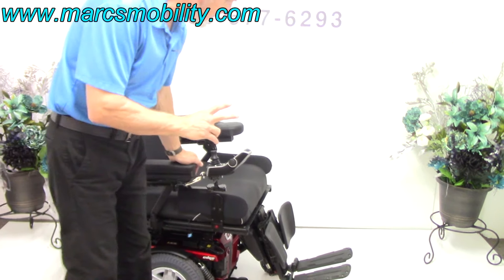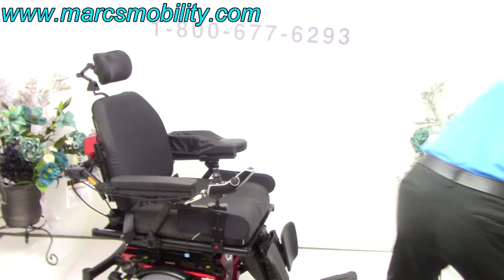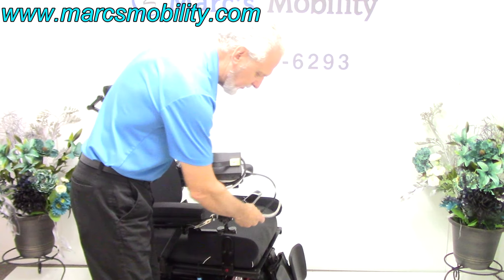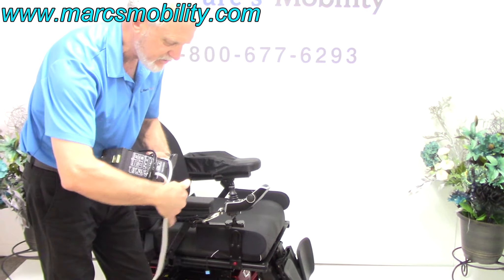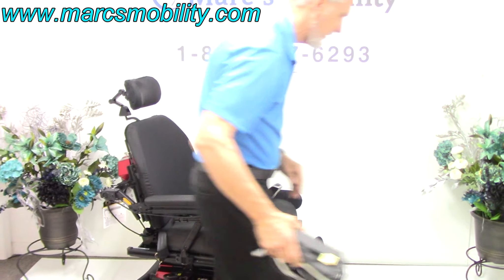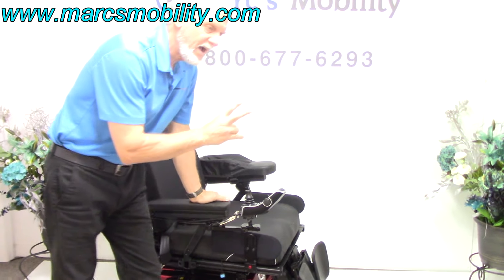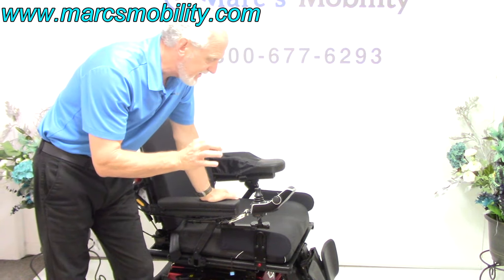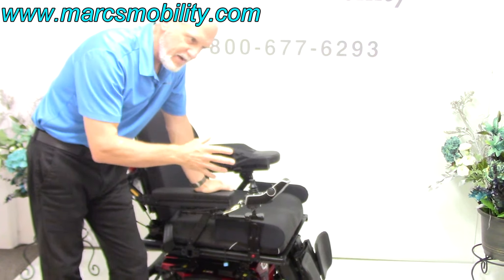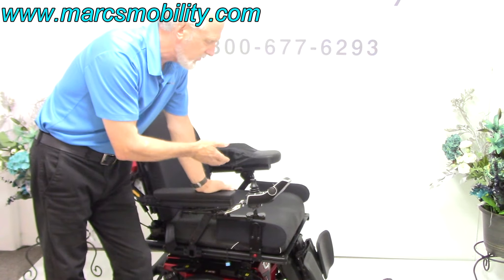There are two batteries in this chair. To charge it, plug the charger in below the joystick. When the light turns green, it's fully charged — you don't need to worry about overcharging because the charger shuts off automatically. These are heavy-duty 75 amp-hour deep cycle batteries that give about 13 miles per charge, depending on user weight and how it's driven.